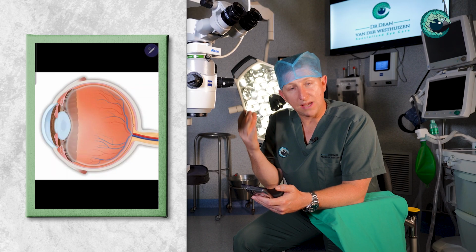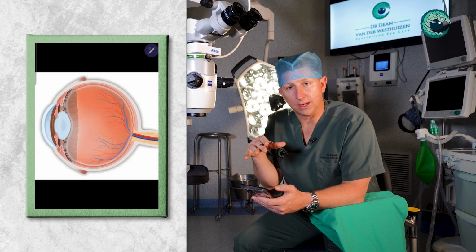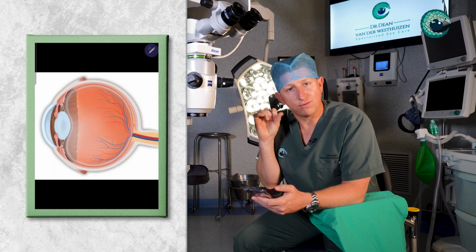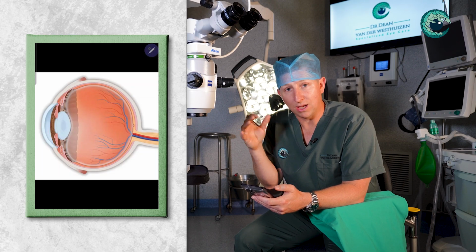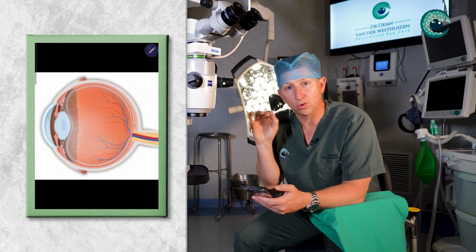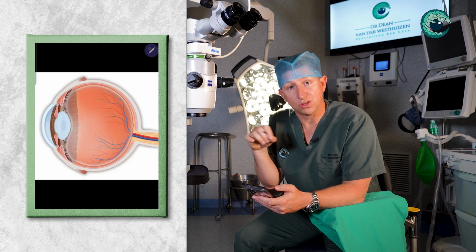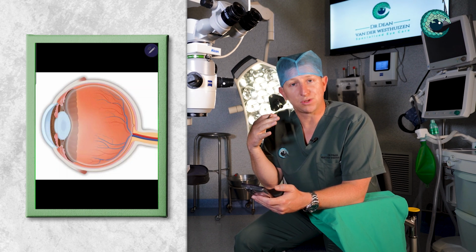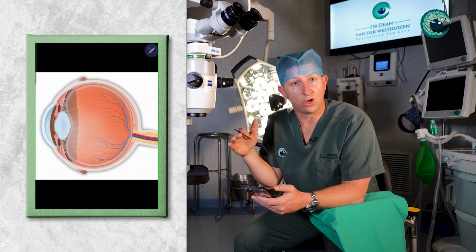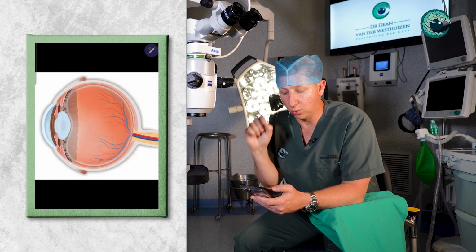Basically, we normally use 3 ports, sometimes 4 ports. I'm going to show you what those ports look like now, but essentially they are very, very tiny holes, like little keyholes. You can think of it as micro keyhole surgery because we do all our work through these small ports. These ports often don't need to be sutured, sometimes they do, but they're so small that they're sometimes self-sealing. There's often a perception that to access the back of the eye, one needs to make large incisions, when in fact we access it through very small little holes in the back of the eye.